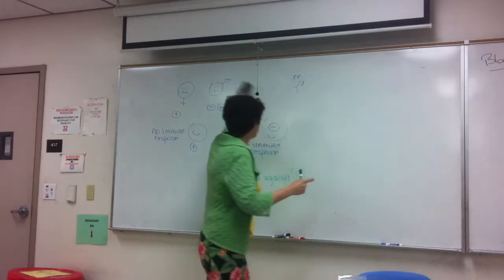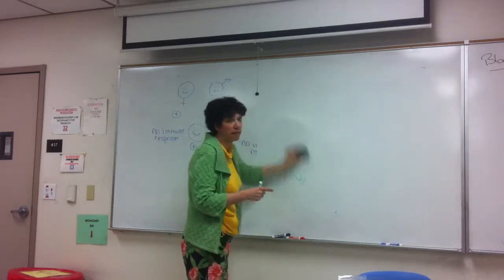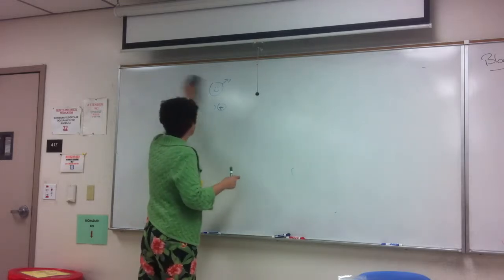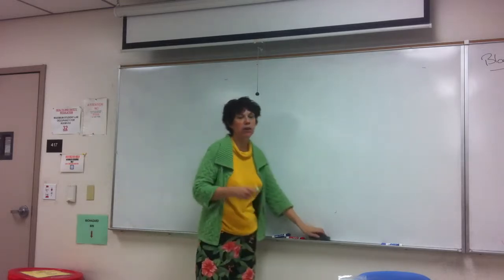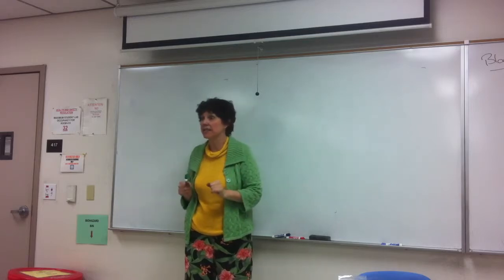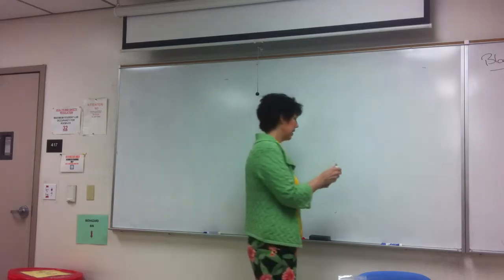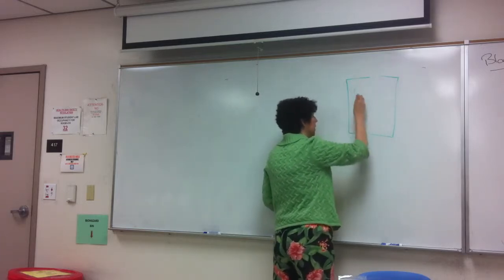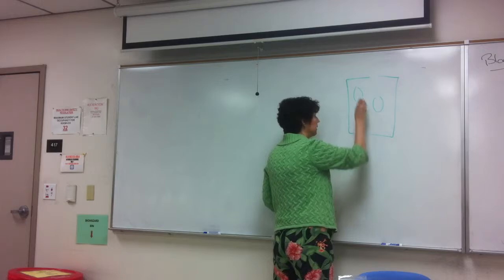on your ability to figure this out. We'll start with the easy stuff. So when you are doing the lab today, you are going to be fishing for antigens. The trays are set up like this with 3 ovals.